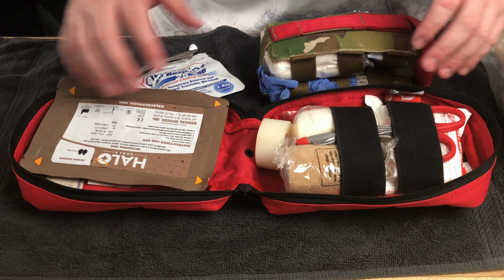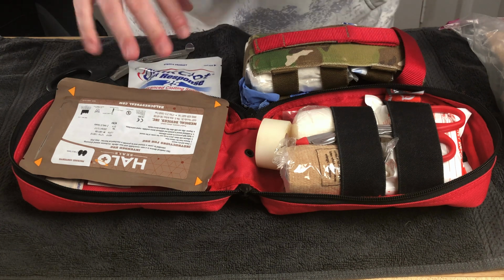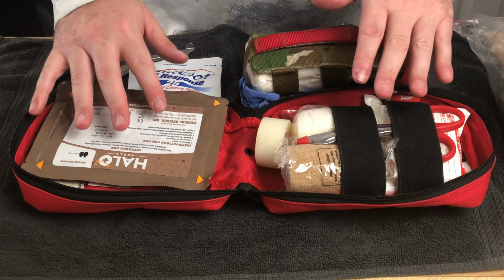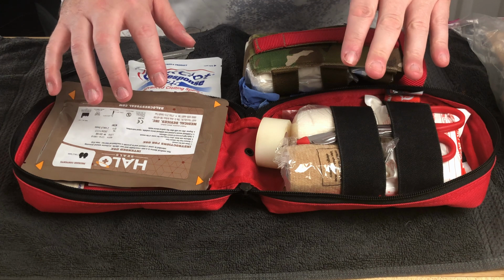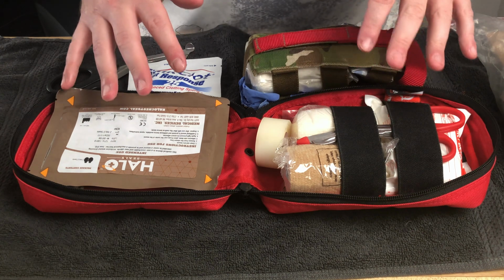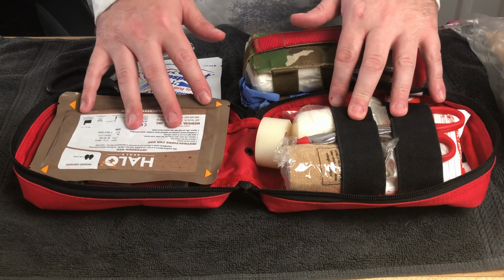So what you're looking at here is actually, I got two different kits here, and then none wasn't in the kit. This is a general purpose first aid kit that I bring to events. Goes to the range with me, goes to if I go to a convention, if I am traveling. Kind of a combination of a general household first aid kit and a trauma kit.